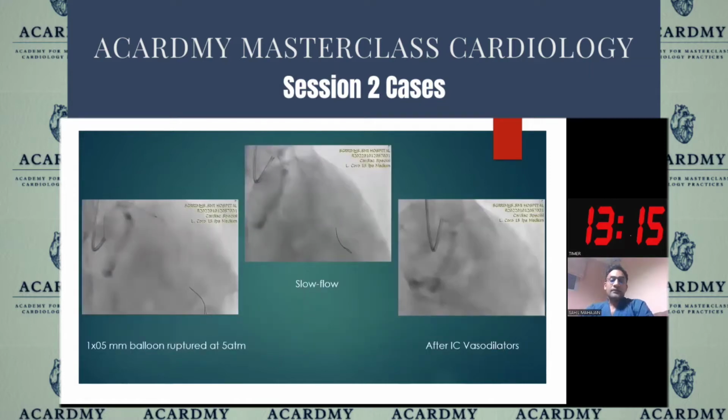So this lady, we took her up and we wired with a regular 0.014 workhorse wire. After that, we tried crossing a 2.0 by 10 balloon. It didn't cross. Then we downgraded our balloon to 1.5, and this balloon also didn't cross. And in an attempt to dilate, it got ruptured only at 5 atmospheres.